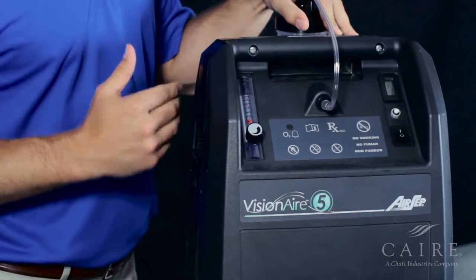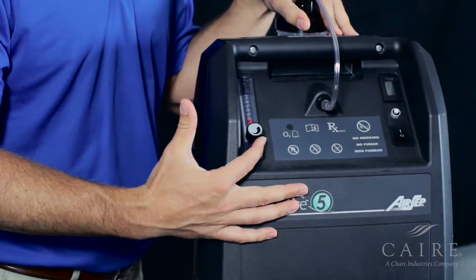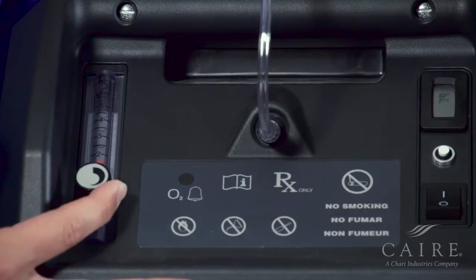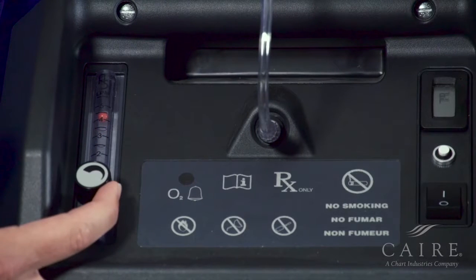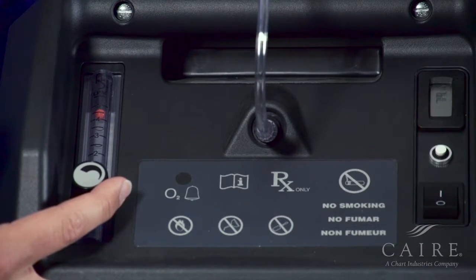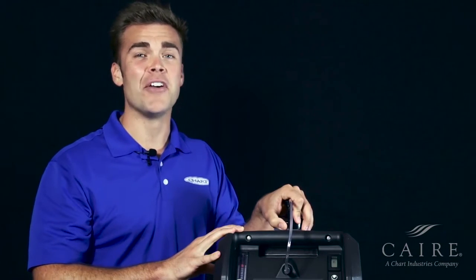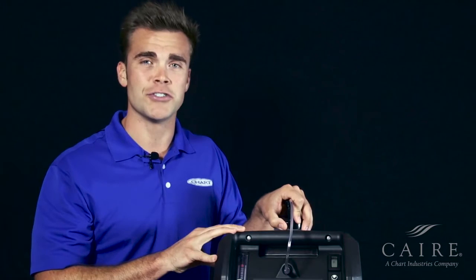Once the concentration is above 85%, the yellow light will go away. Now that the unit's on and it's warmed up, notice the light is no longer illuminated. You can adjust the flow meter — simply turn the dial counterclockwise until you've reached the desired setting. And there you have it — that's the basic functionality of our Visionaire 5 oxygen concentrator.